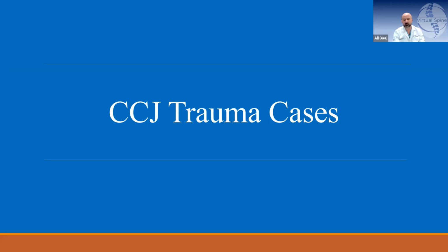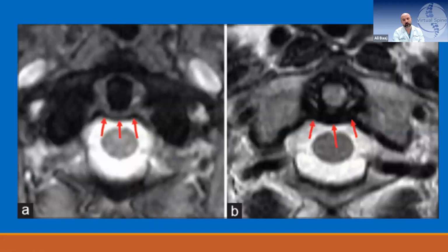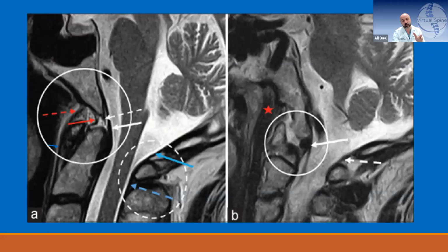Again, back to the neuroradiology aspect of assessing the ligaments, where you've nicely laid out what it means to have a torn ligament. For us in surgery, the dogma is that ligaments don't heal as well as bones, right? But have you been involved in work, or have you seen follow-up MRIs on torn or injured ligaments where, using MRI, you've actually seen healing? And what does that look like? Is the ligament back to how it would otherwise look, or does it form scar in the area? How does a healed ligament look on MRI after it was torn, I guess?